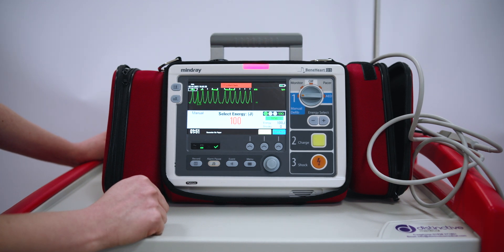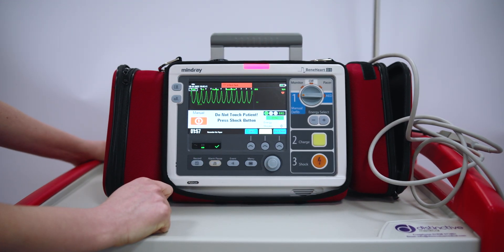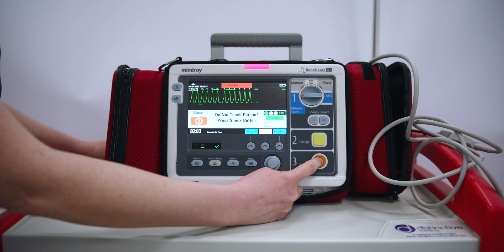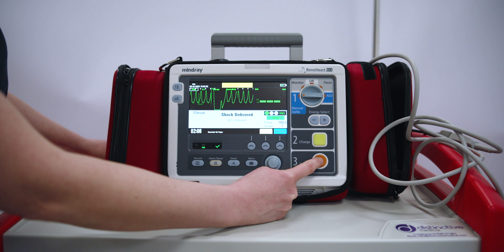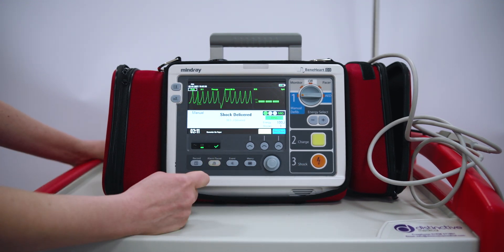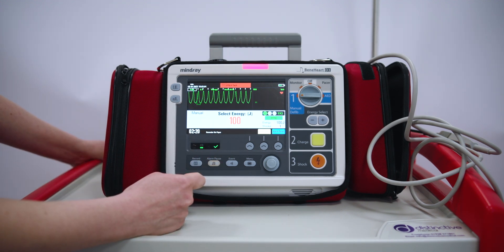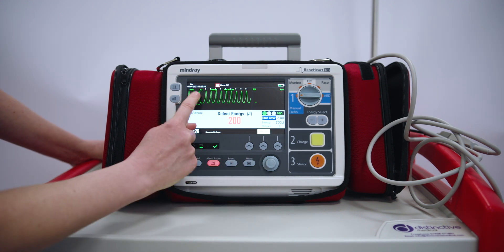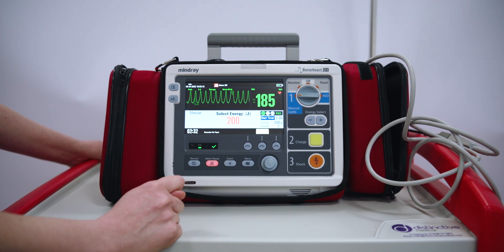I remove oxygen as you would in a crash and charge. We start at a lower joule for synchronised cardioversion. Everyone away, oxygen away. I shock and hold the button down for an extra two seconds — that's so we are delivering the shock on the R wave. As you can see from the monitor, we are still in sync. To take it out of sync, we press exit sync. The white dots have gone and we are not flashing in sync anymore. That's cardioversion.